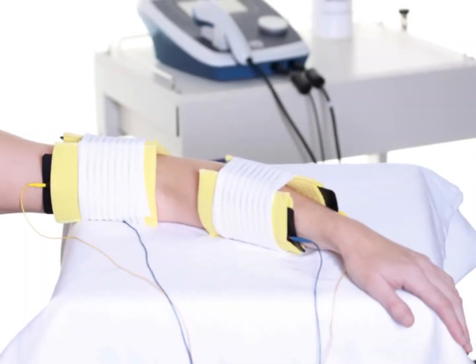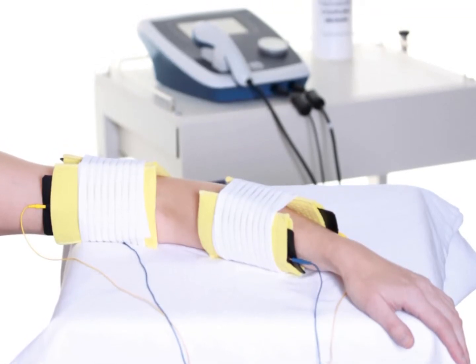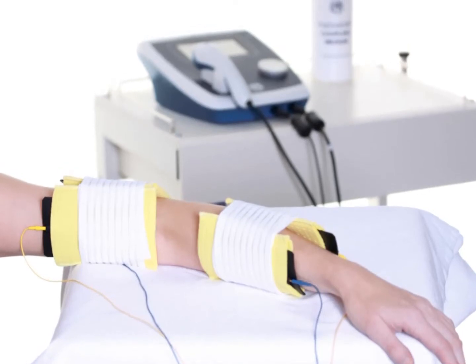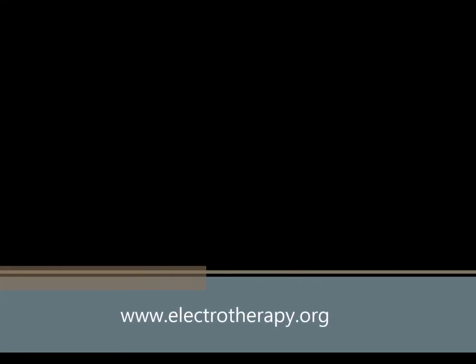What's more, if you choose, you can treat one patient with ultrasound and another patient with stimulation at the same time. We recommend you take a look at our modalities explained area of our website for in-depth information on the benefits of combination therapy, or you can visit www.electrotherapy.org for independent information.